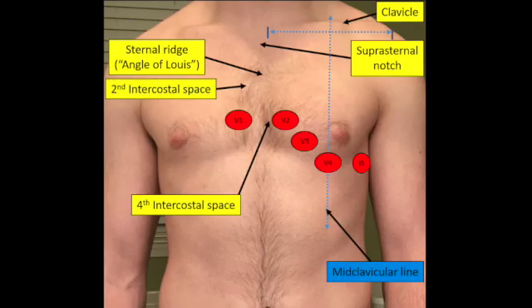Okay, so on the screen now, this is the picture with a guy. A super fit guy. Not that guy. Let's be clear about that. You don't have to worry about all the yellow boxes on this screen. I want you to just mainly focus on these lead placements. Now you understand that these lead placements are measuring that electricity, that energy that's coming down the heart and then going back up for repolarization. And so that's why those leads are placed there.